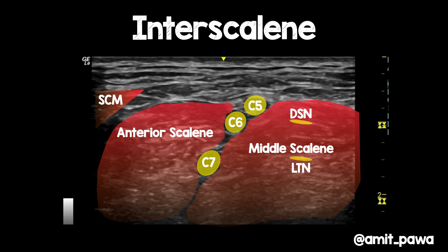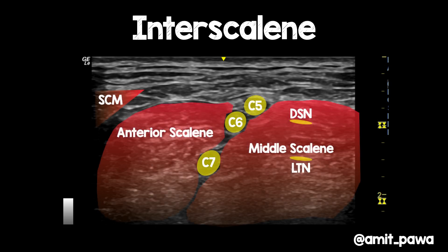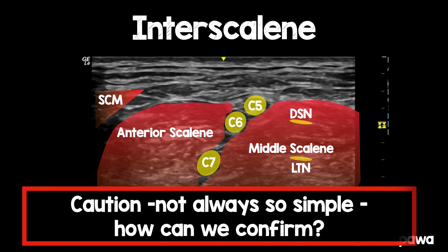If I remove that overlay for a second, you can get a suggestion that there are circular hypoechoic structures here. This second one has got a suggestion of a bifid appearance, which is classical of C6, and then this is C7 down here. But again, if you were to look at a static image of the middle scalene muscle, you wouldn't necessarily highlight these structures as being the long thoracic and the dorsal scapular nerve. There are some anatomical variations to be aware of.